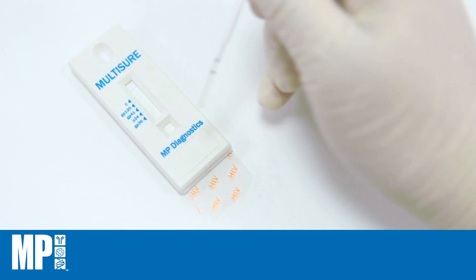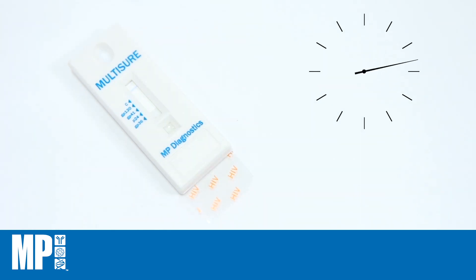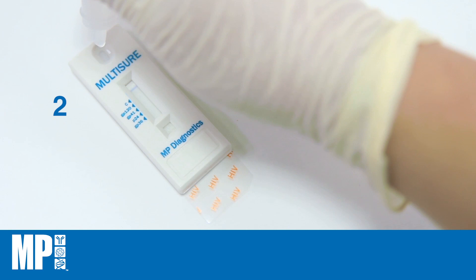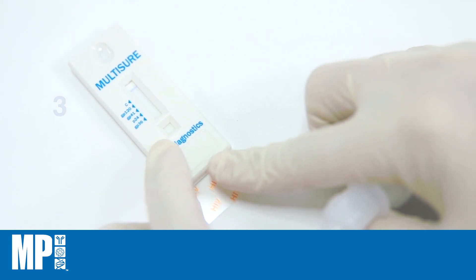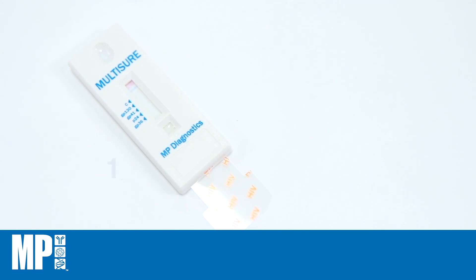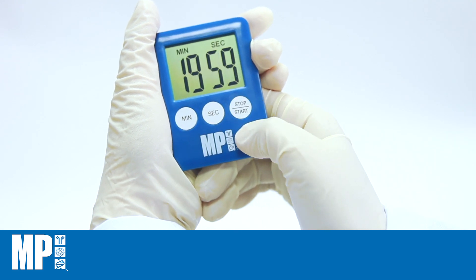Add 25 microlitres of serum or plasma sample into the square well. The sample will start wicking up the membrane. When the sample front reaches the blue indicator line, add three drops of Chase Buffer into the oval well. Pull out the pull tab until resistance is felt. Add one drop of Chase Buffer into the square well. Start timing and read the results at 20 minutes.